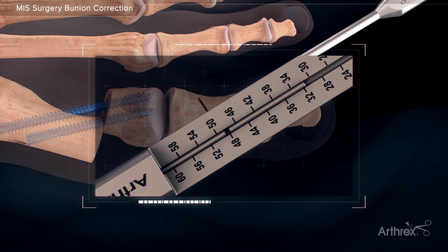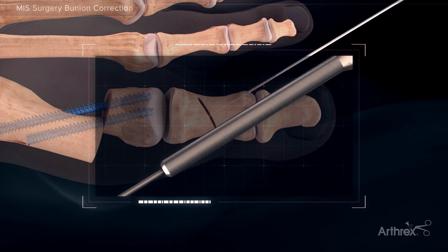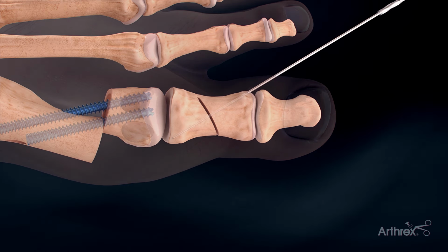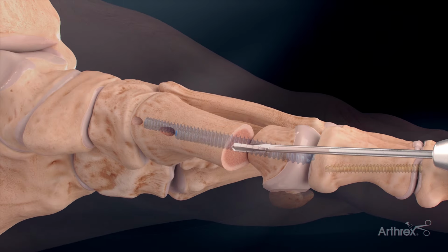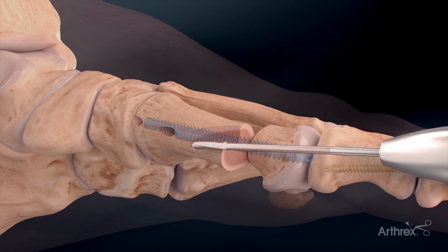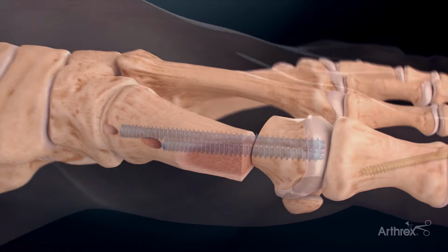An incision is made with the beaver blade and the wire is measured. Drill over the wire with the cannulated drill, and finally insert the 2.5 compression FT screw to complete the construct. Finally, if necessary, the redundant bone shelf can be removed utilizing a 2.9 mm wedge burr. The incisions are closed, a compressive bandage can be applied, and the construct is complete.